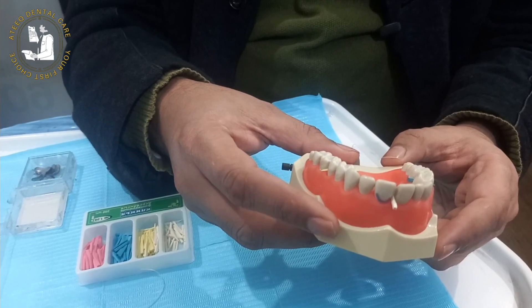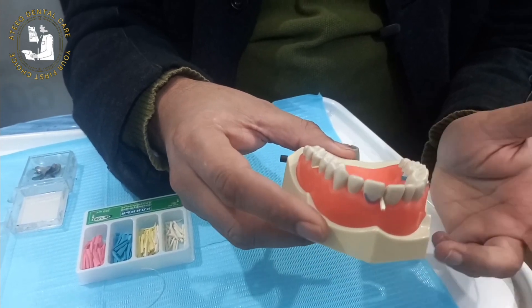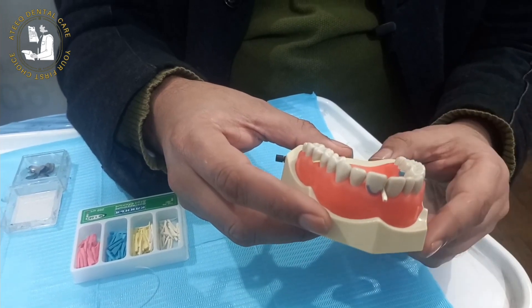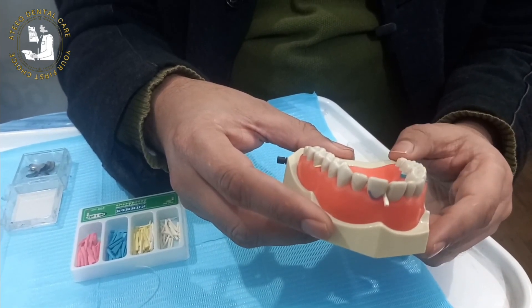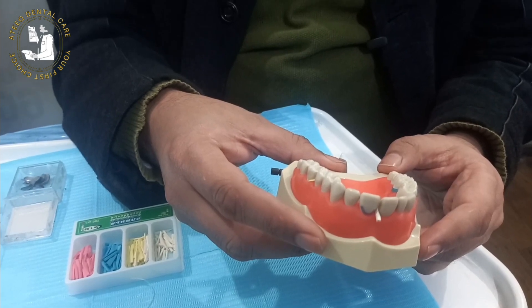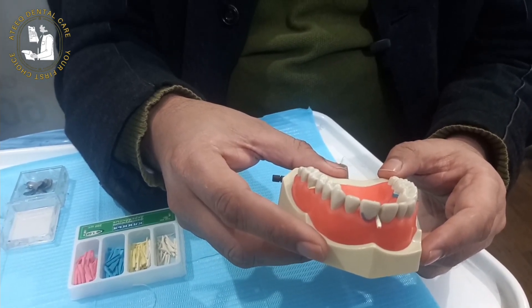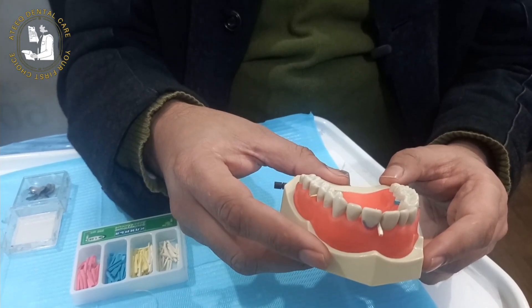Today's lecture is related to the wooden wedges. Wedges are basically interdental wedges, triangular in shape, available in different colors and different diameters. They are also available in plastic form, but usually we prefer wooden wedges for achieving a tight contact between the restoration.